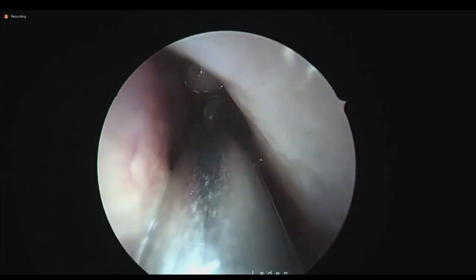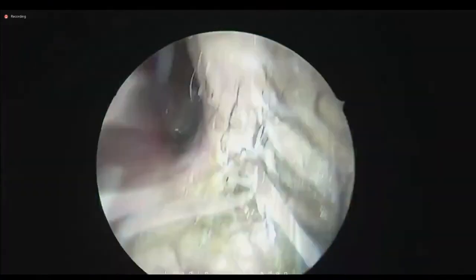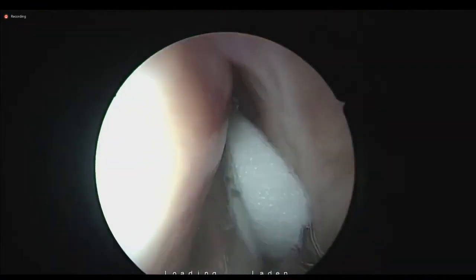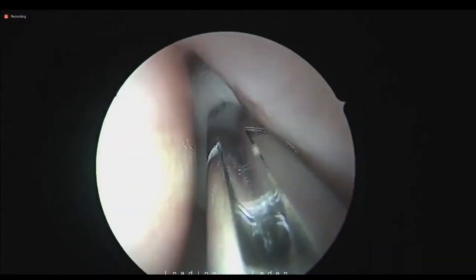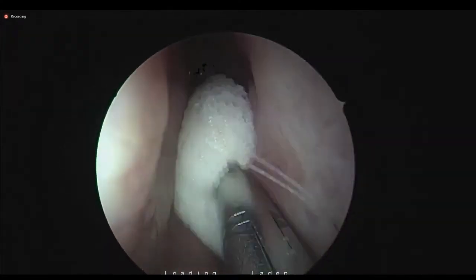What we believe is, if you do proper pre-operative preparation and intraoperative preparation, you ultimately achieve the same quality surgical field, even without the infiltration. So here I am doing topical. See, the aim of the topical is to apply adrenaline to the mucosal surface everywhere to decongest it.